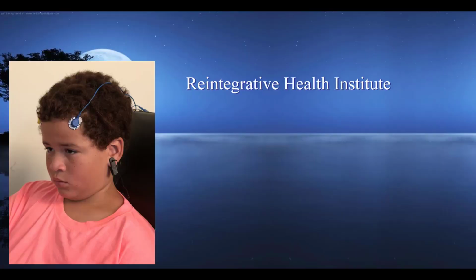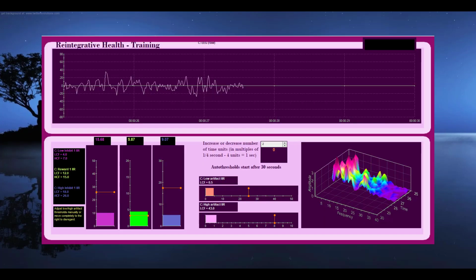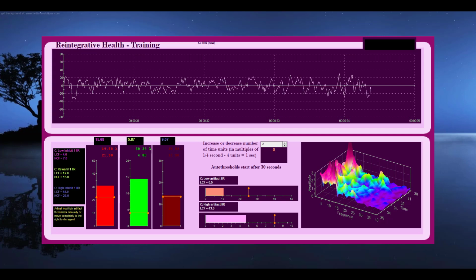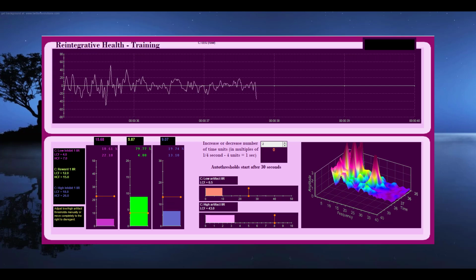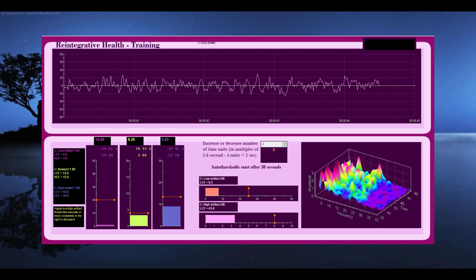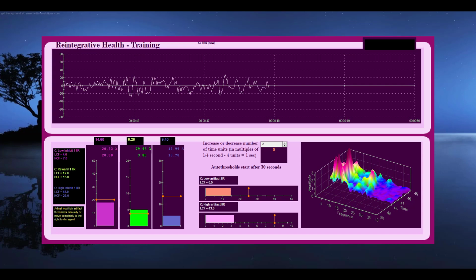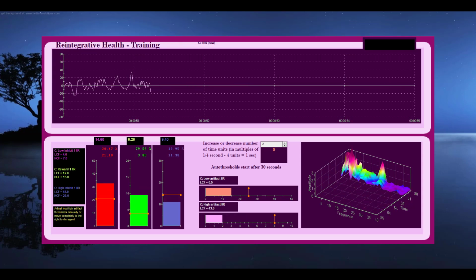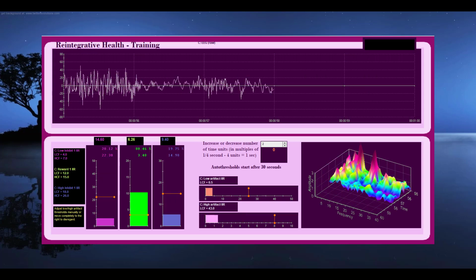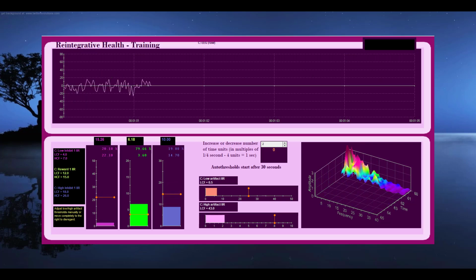Once these deficits are determined, neurofeedback therapy may be an option for treatment. A neurotherapy session begins with the placement of electrodes on the head based on the quantitative EEG analysis. This screen allows me to create the complex feedback criteria that guide treatment. Feedback is a 3-step process. First, EEG is recorded second by second. Next, the EEG recording is compared to the changes needed as determined by the quantitative EEG. Now feedback begins. When the EEG pattern changes, something changes on the screen in front of the person in treatment. The next screen will show exactly what this looks like.